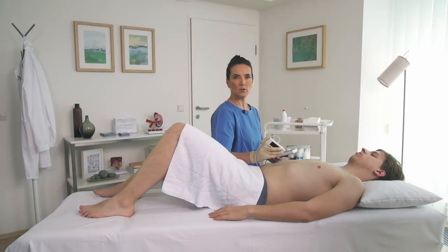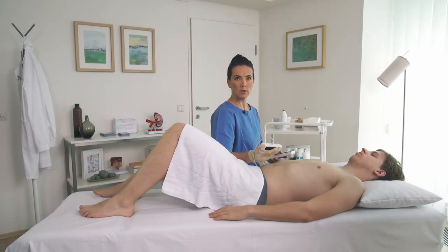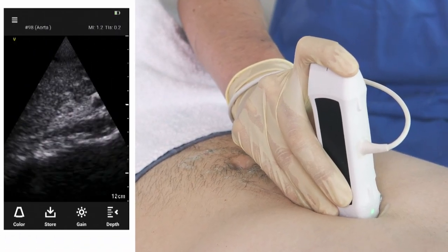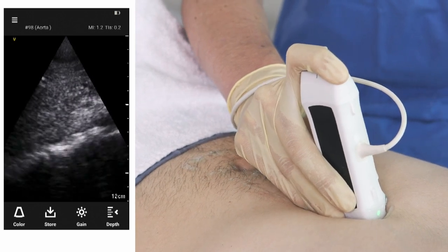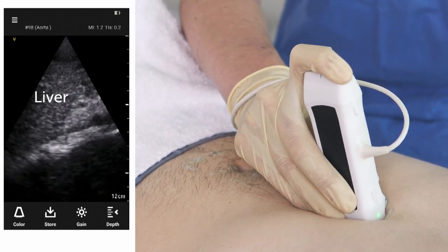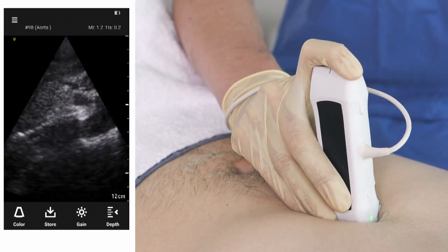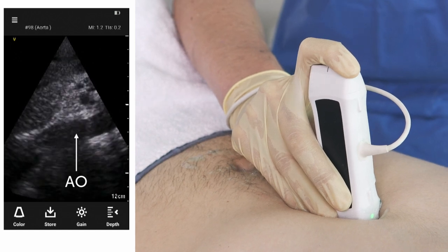We continue now the exam of the abdominal aorta in the longitudinal view. The marker is pointing towards the head of the patient. The first landmark you can see again is the liver, and by tilting the probe slowly to the midline of the patient, you can appreciate the abdominal aorta.